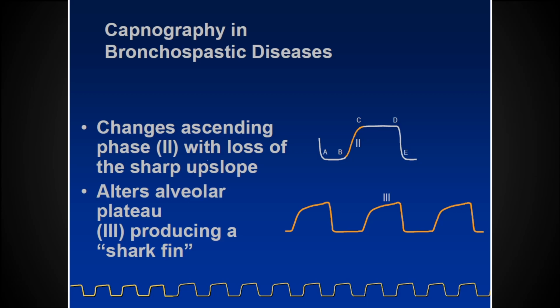Yeah. Would pneumonia also present with shark fin? It can. Okay. Basically, before I taught you, that means bronchospasm. Give albuterol and Atrovent, which is a good way to start. Sometimes mucus will do that too, because CO2 does have a hard time getting through mucus. Now, you can't know which one it is really, so I'm going to go ahead and give albuterol and Atrovent as long as it looks like that.